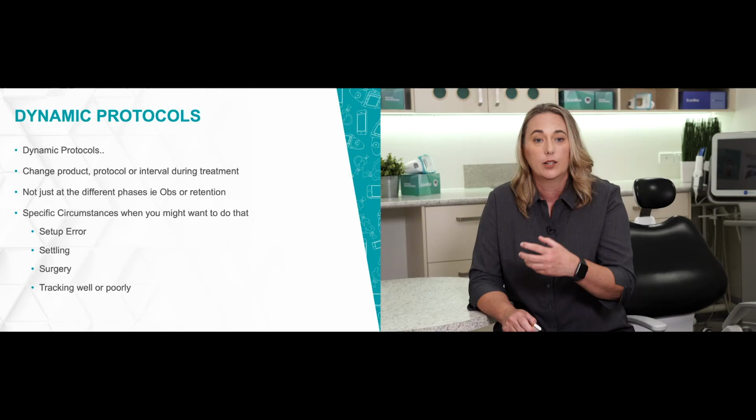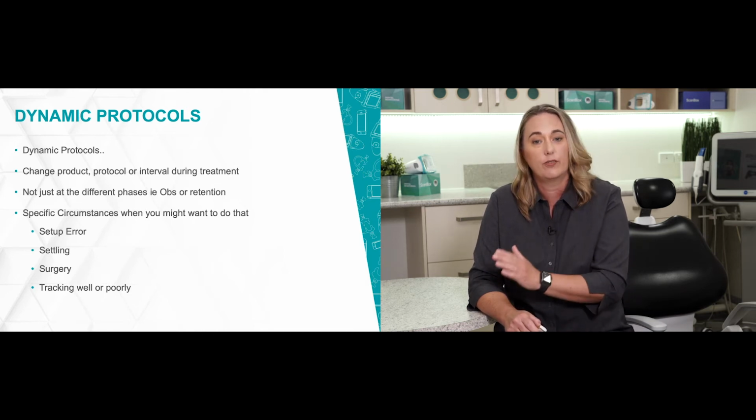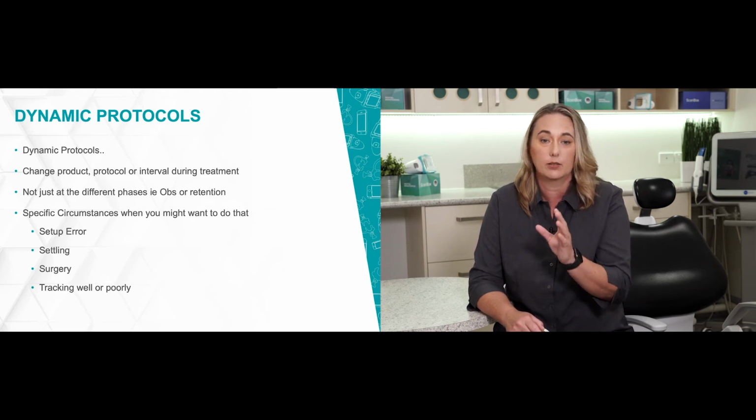And then, as I said, we're going to look at how we want to change that. So making it dynamic means that we're changing the product, the protocol, or the scan interval during treatment, not just at the different phases of treatment, because your scan interval may well vary for your OBS or retainer patients. But there are specific circumstances where you might want to alter the protocols that you already have established.